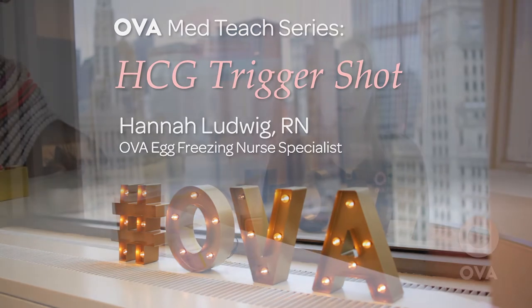Hi guys, it's Hannah. I'm a nurse here at OVA Egg Freezing. I am going to demonstrate how to do your trigger shot today.